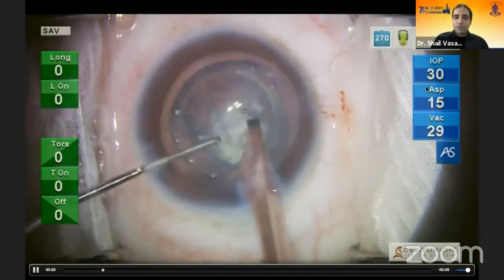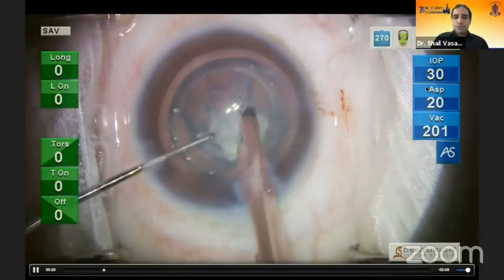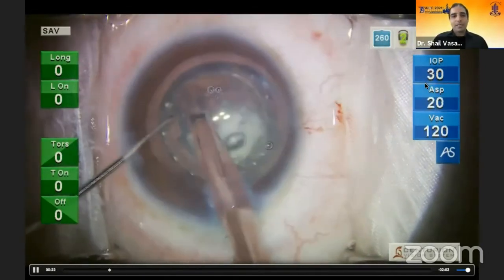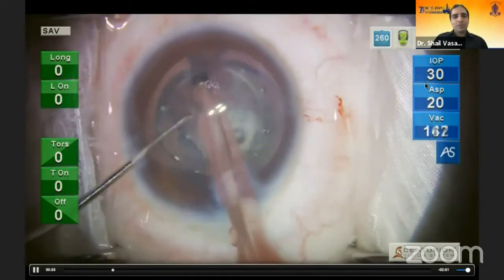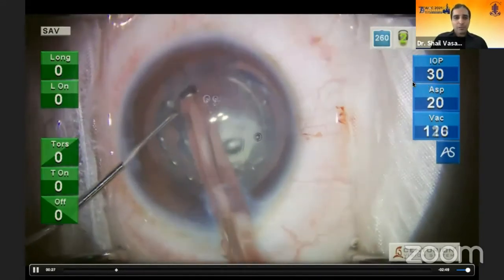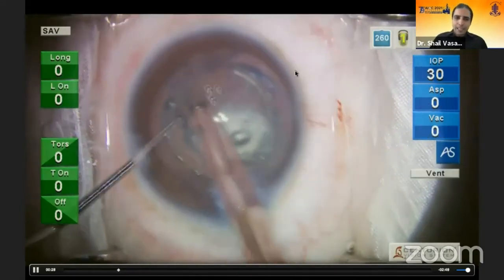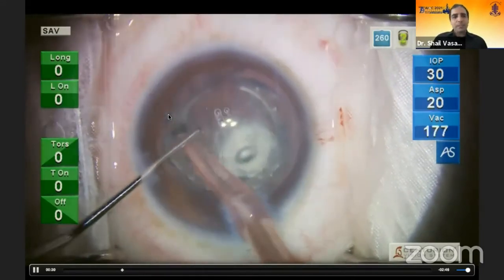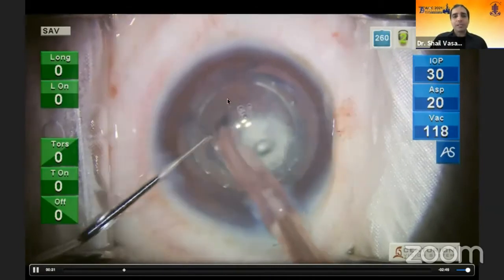On anterior segment OCT, there is a pre-existing defect with lens matter already in the anterior vitreous. The aim is to ensure this does not progress or lead to a dropped nucleus or make in-the-bag IOL implantation difficult. Therefore, we use low parameters: an IOP of 30 and a flow rate of 20 — an IOP of 30 is equivalent to a bottle height of about 50. We detach the epinuclear plate but do not remove it.